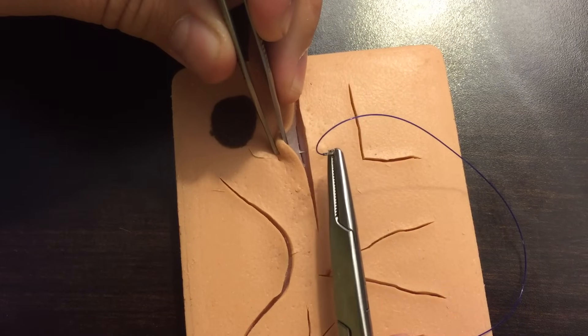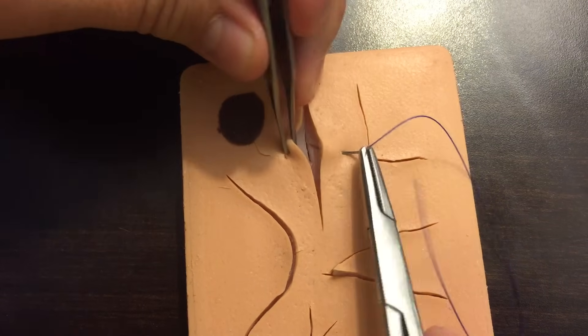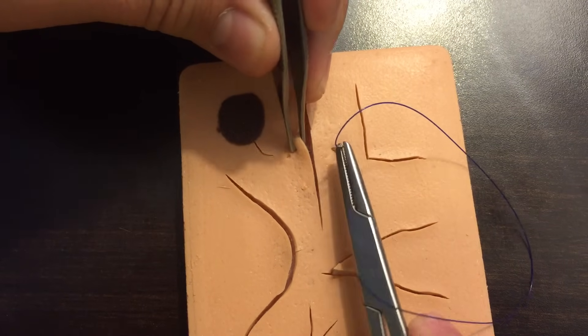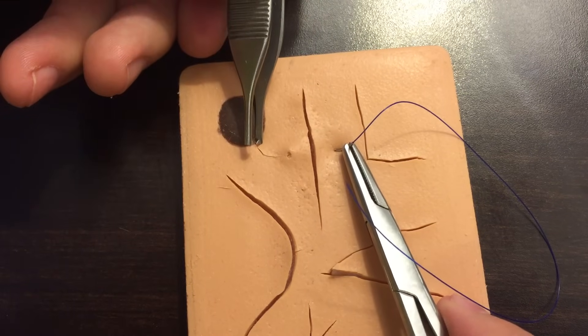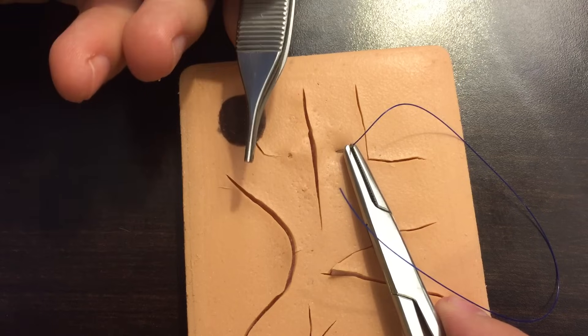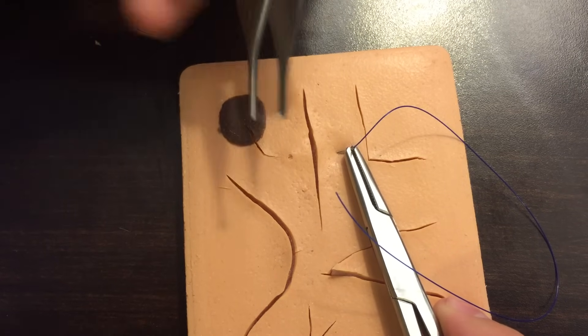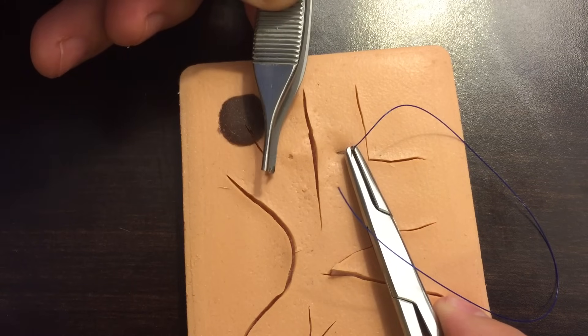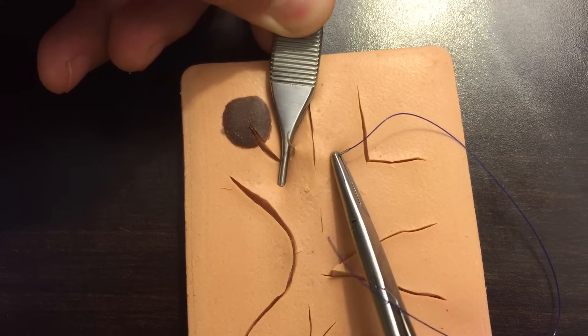As you go to the other edge, make sure you're staying at that exact same depth — however deep you are on one side, enter at the same depth straight across. You want to exit again at 90 degrees. One thing I like to do is use my pickup to push down on the skin here, which helps me get that 90-degree exit.